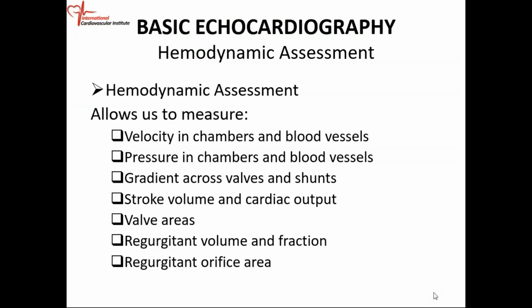Okay. So we can use hemodynamics to calculate velocities in chambers and blood vessels. If you remember when we did Doppler, we look at the velocity of moving structures.